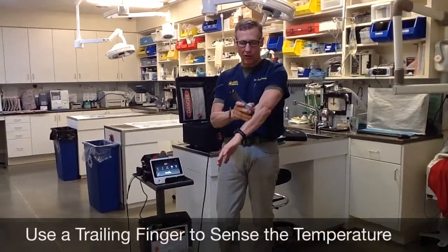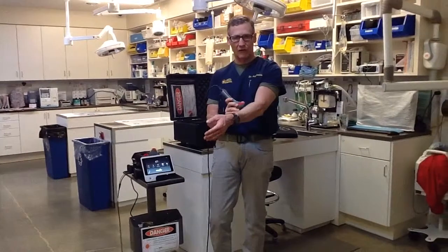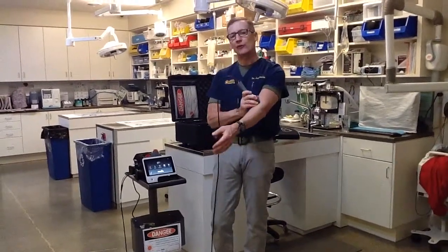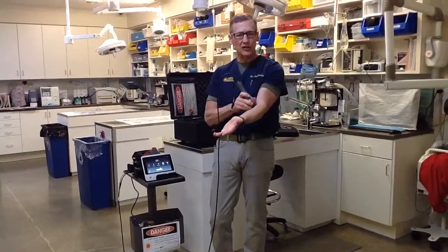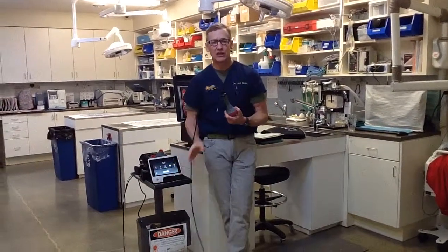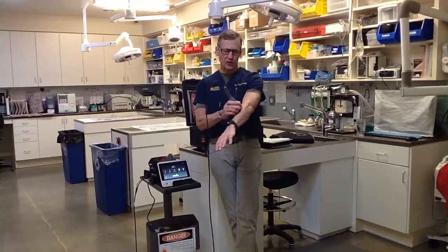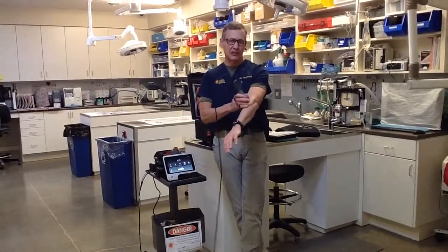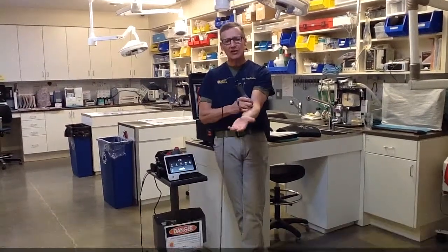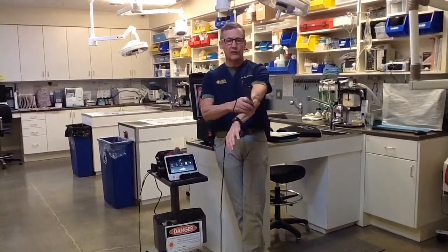When lasering, I like to have my pinky dragging along the tissue — I call that the trailing finger technique — which lets me sense how warm the tissue is getting. With darker animals you'll feel the tissue get a little warmer; with lighter animals, less so. That analogy of a dark car versus a light car in a parking lot — it doesn't make a real difference because the software adapts energy and wavelength based on coat color and skin color parameters you enter.